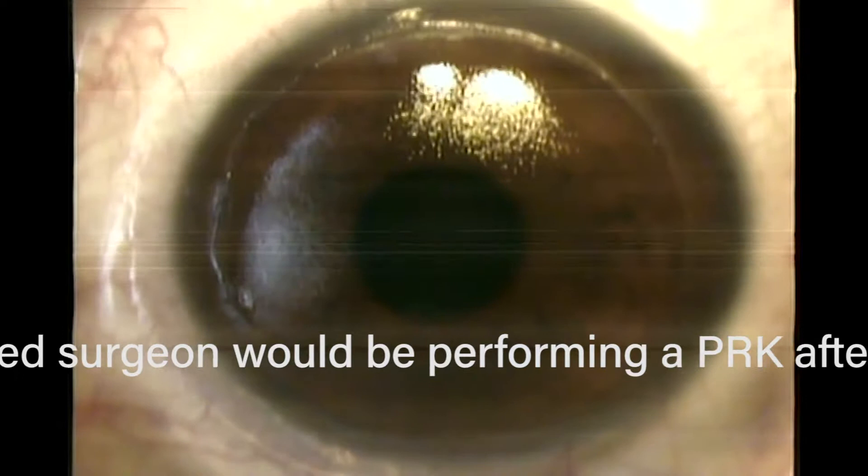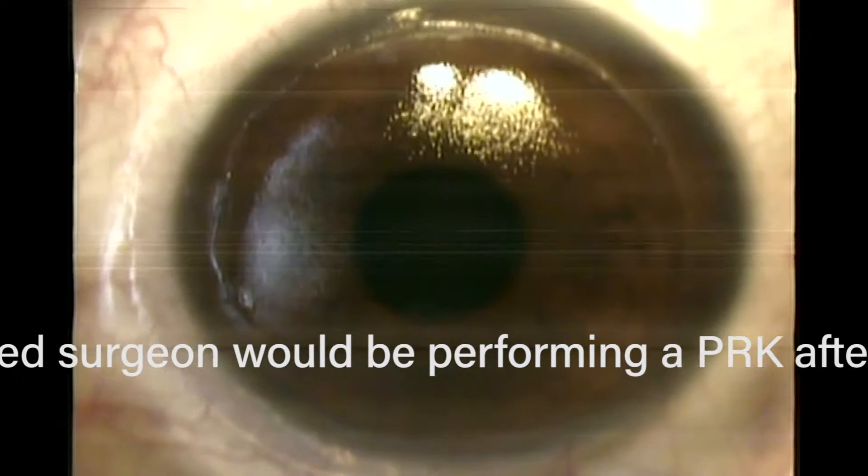It's still not a PRK, which we're going to narrate next. You can see it's a very clean edge. When you look at the edge of the cornea epithelium junction, it's totally clean, and that's why it grows back so quickly and there's no pain. The patient's looking around now, but it really doesn't matter because the laser is done.